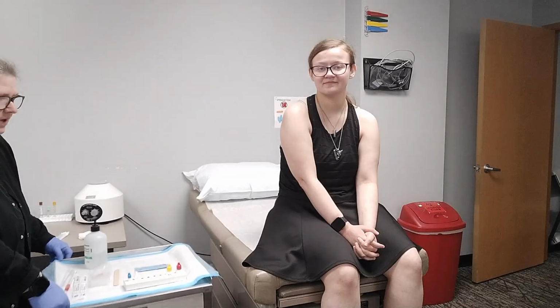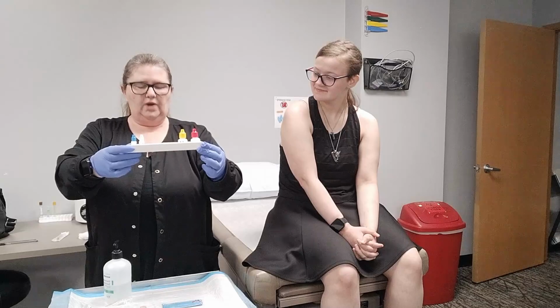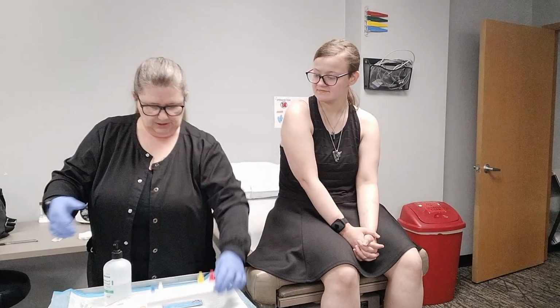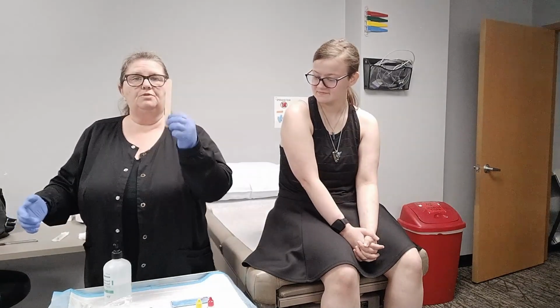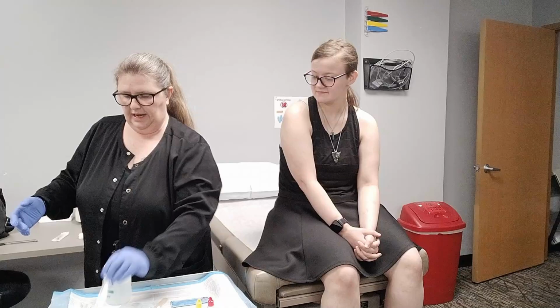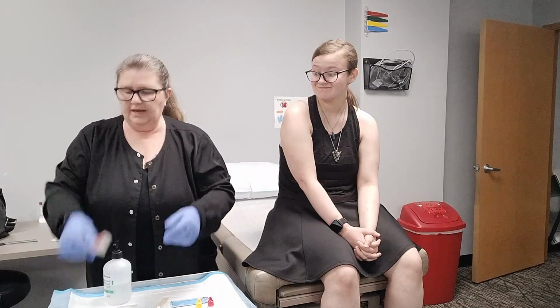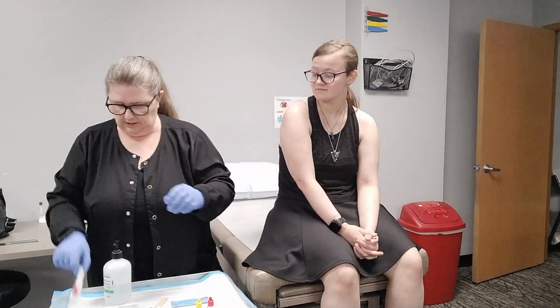And then what I have set up on my tray here, just bring this forward a little bit, not to scare my patient at all, is my tray that's going to hold my test tubes, and I have my reagent liquids. I have the test strip, a tongue depressor, the test tubes, and a sterile applicator or cotton tip swab. And then I also have, just to show you, a transport swab as well, okay?